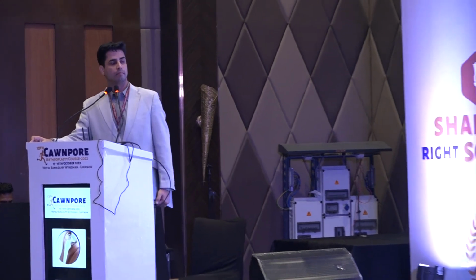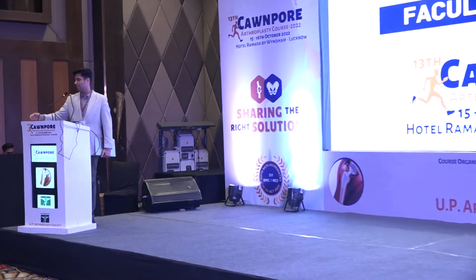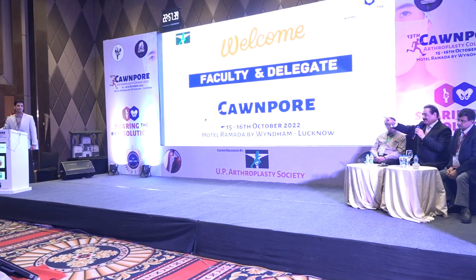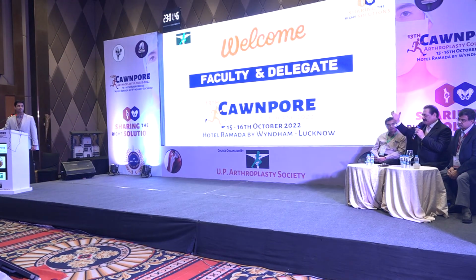Right. Rajiv, the biggest advantage of ETO I see is in a patient in whom there is some element of protrusion. It makes surgery so fast and easy. And if you are using a solution stem, I've stopped using it now because I burned my hands in many cases. Solution stem is very difficult to use without ETO. Yeah, I totally agree with sir.